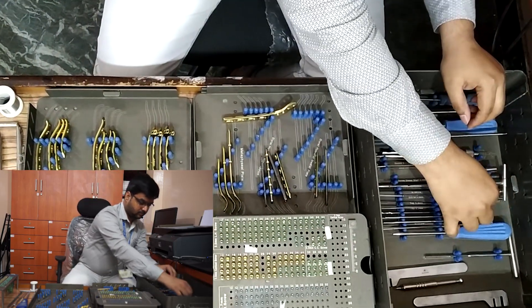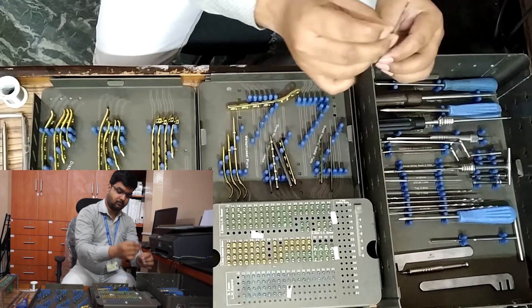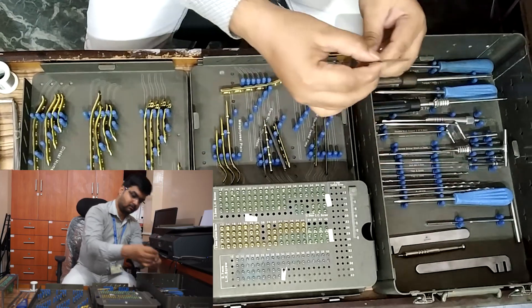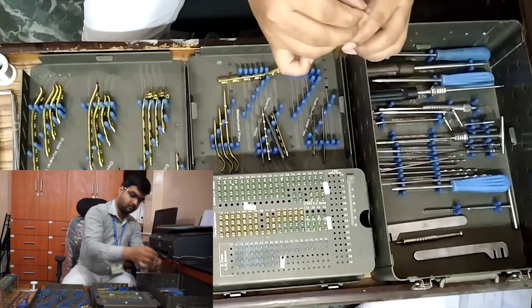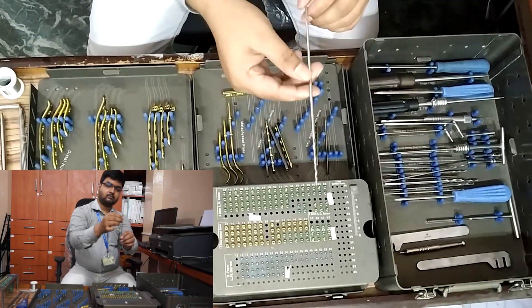Drill bits: 2 mm drill bit, 6-inch length, two pieces; 2.5 mm drill bit, 6-inch length, two pieces; 2.7 mm drill bit, 6-inch length, two pieces; and 2.8 mm drill bit, 8-inch length, two pieces.